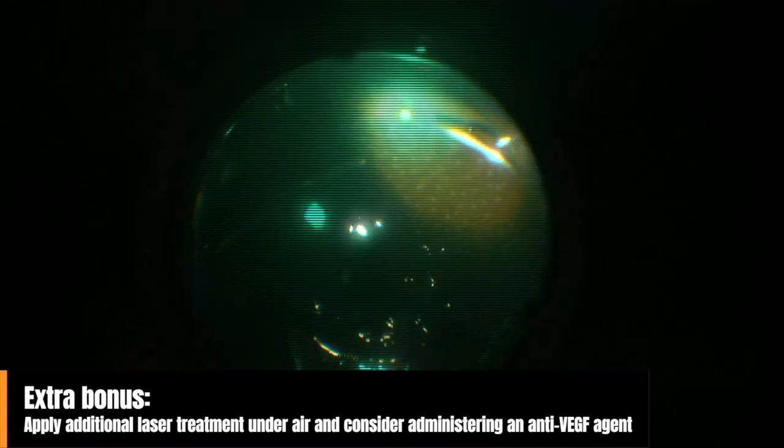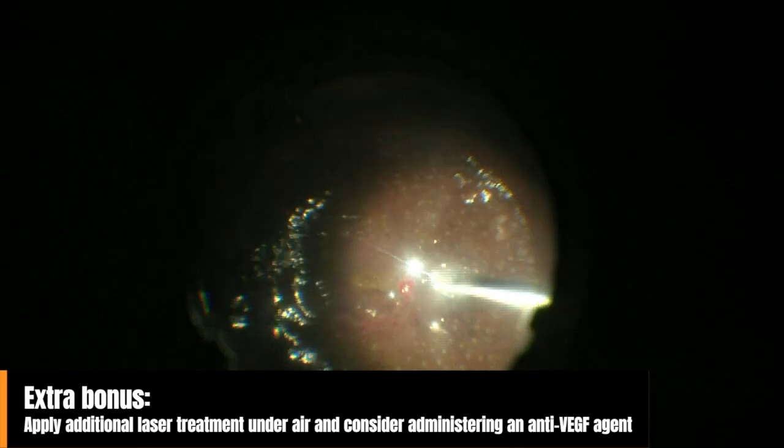An extra bonus to consider is to apply more laser under air, as you can see the periphery better, and I always consider applying an anti-VEGF injection at the end of the procedure before closing the eye.